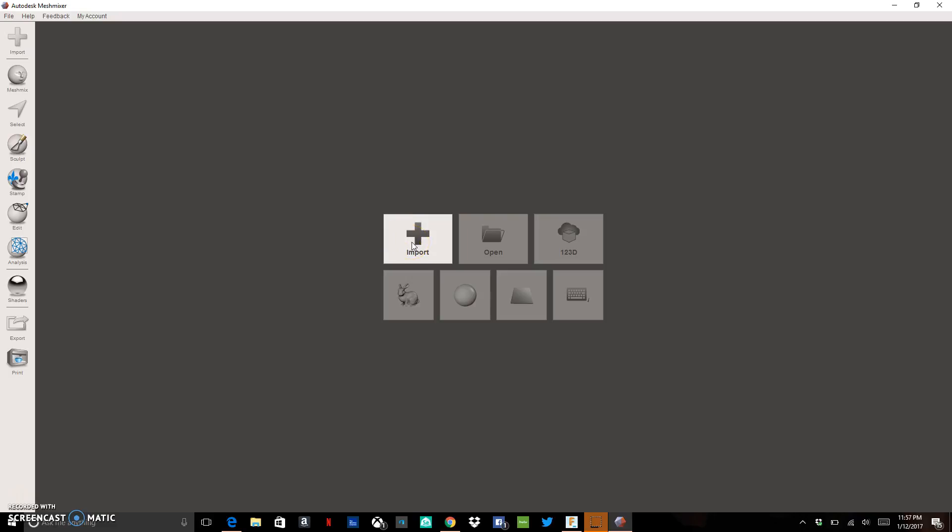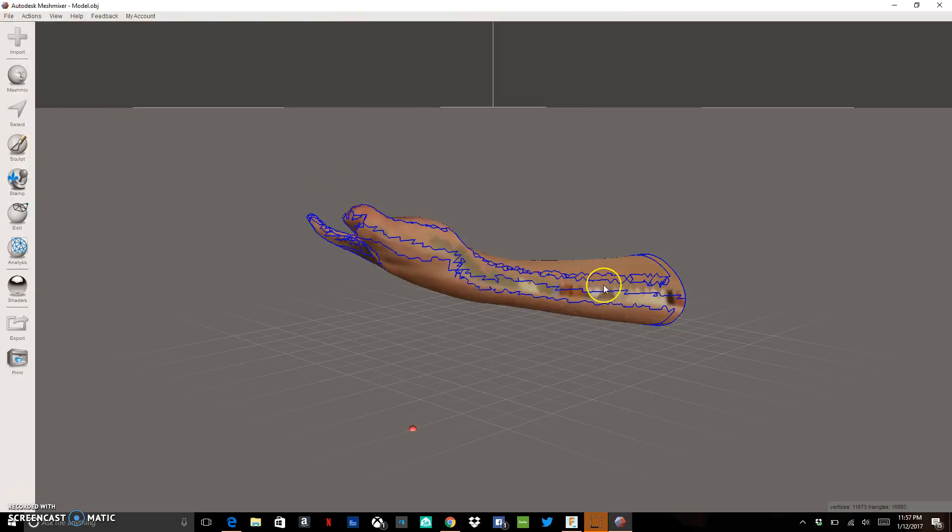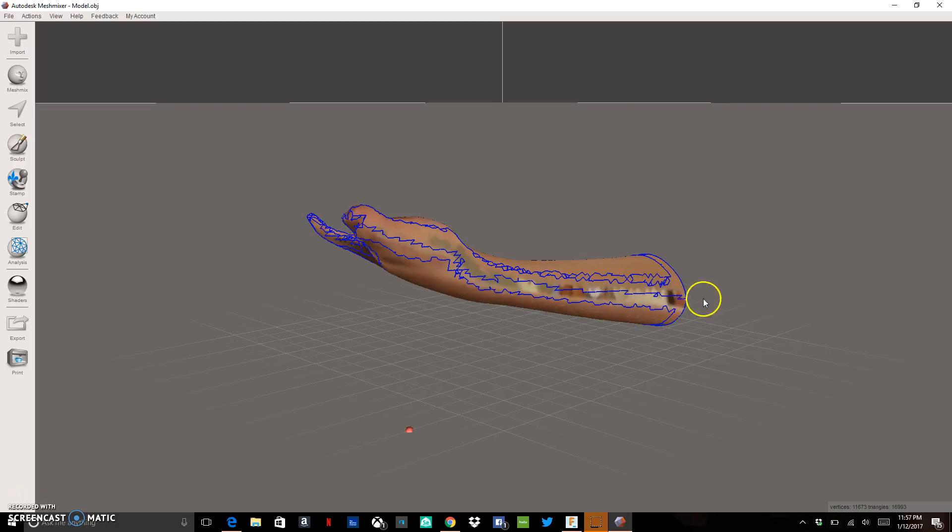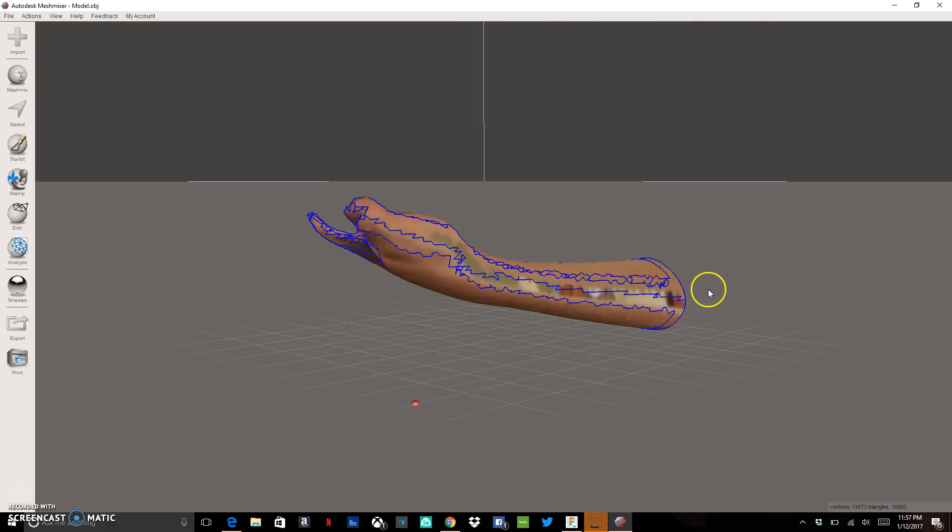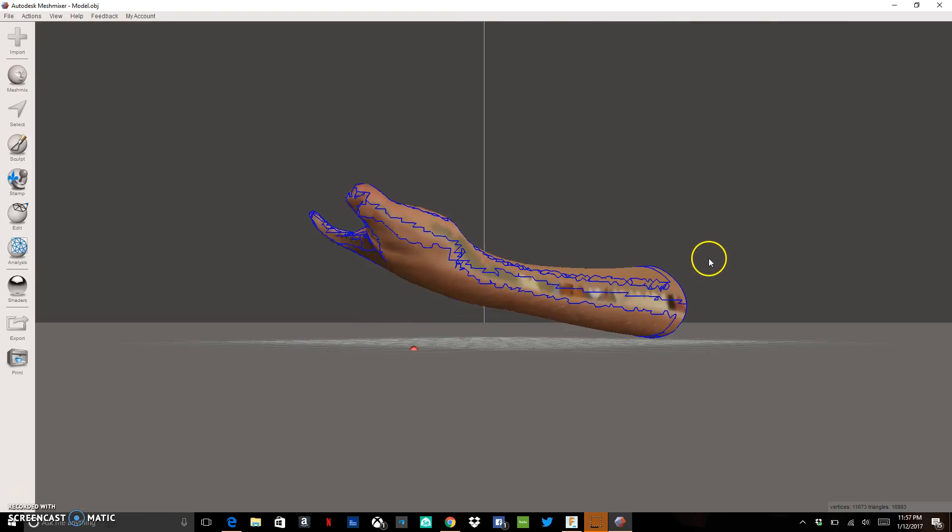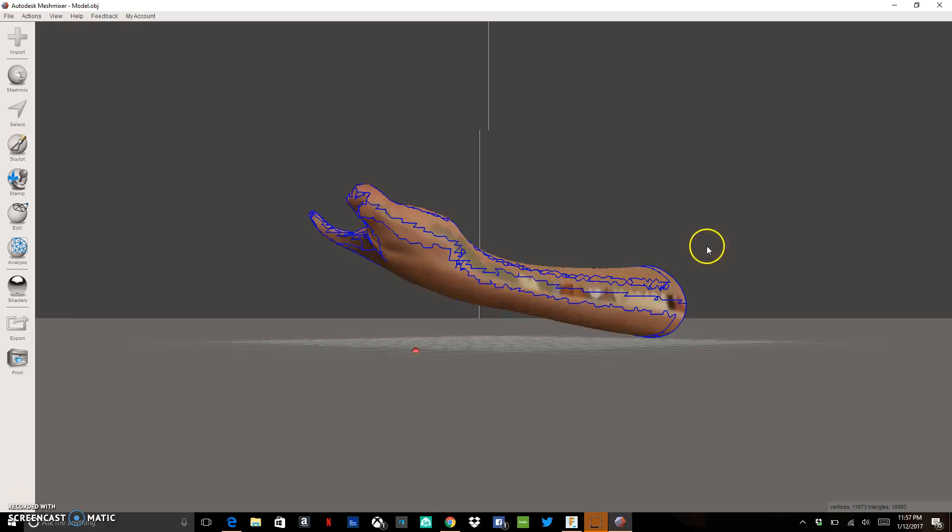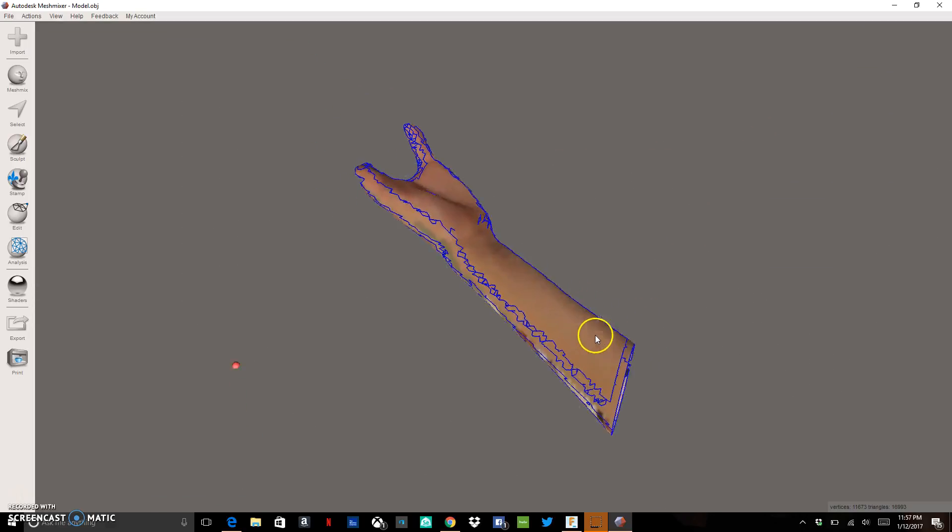So what we want to do is we want to import our scan. I've got mine saved right here under model. This is the raw file that came through my email through my Occipital structure sensor to my PC. So in MeshMixer, you want to hold down the right mouse button and that lets you orbit around your model.